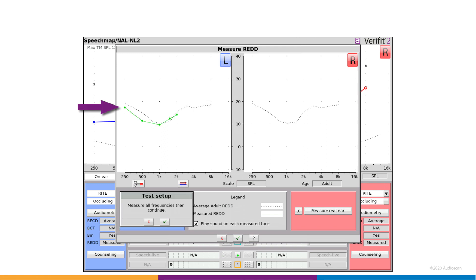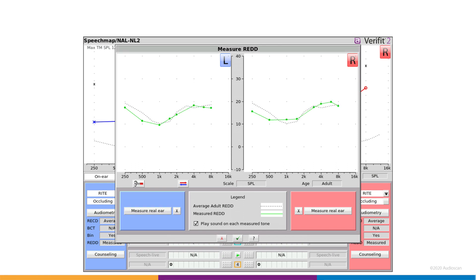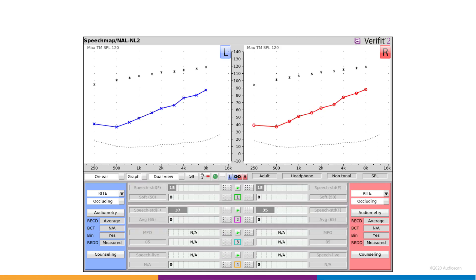When each level is captured, a green dot appears on the graph, and an optional confirmation chime is sounded from the REM speakers. Once complete, the REDD is stored in SpeechMap and will be applied to the entered HL audiogram.